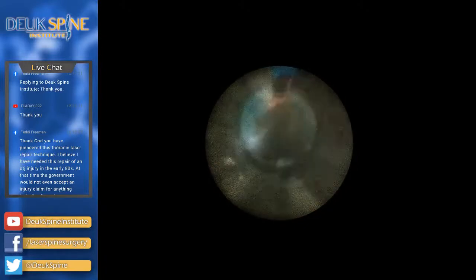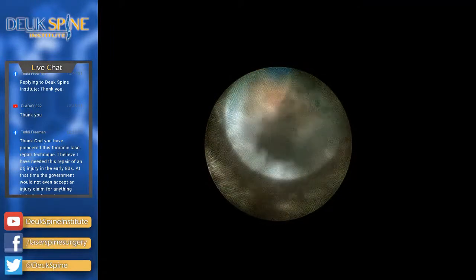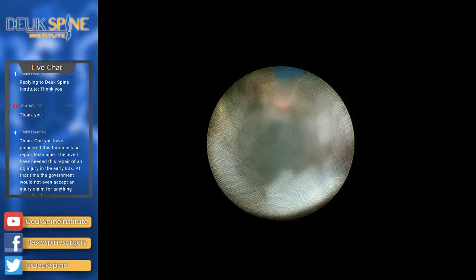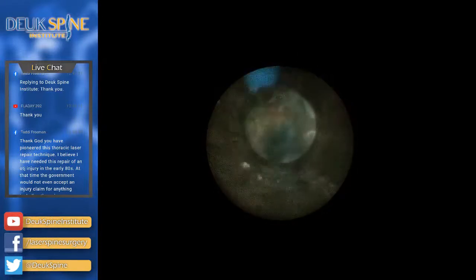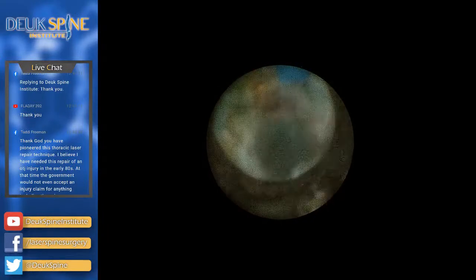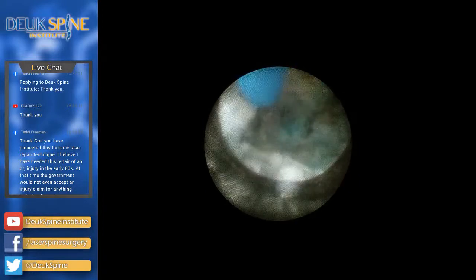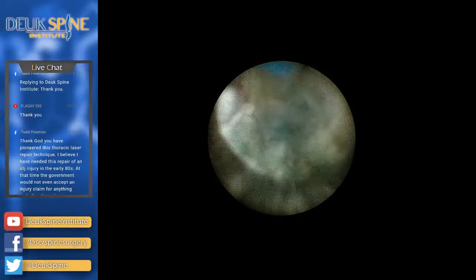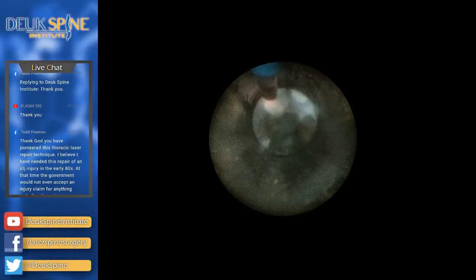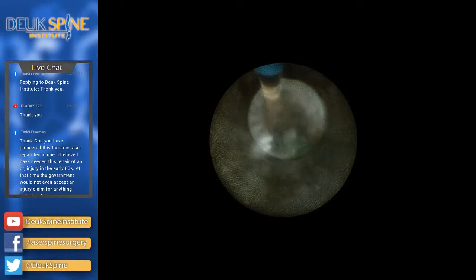Sean, was there another question? None others currently. The reason it's hard to see, folks, is there's actually small pieces of disc material in the water from the vaporization and breaking up of the disc herniation. And that's why it's obscuring your view a bit, and mine, of course. I'm seeing the same thing you are.